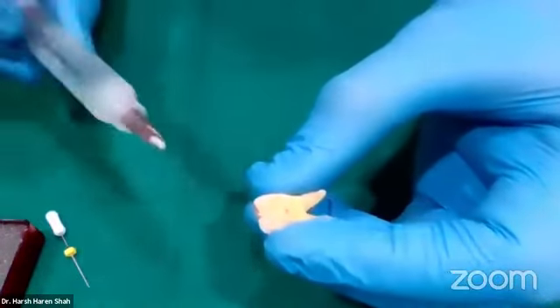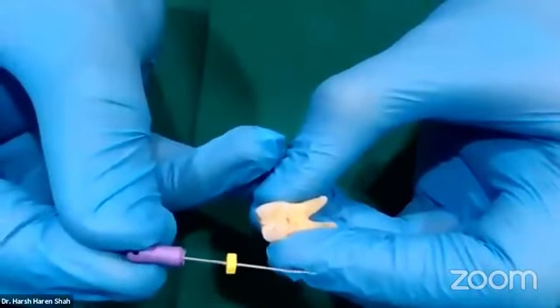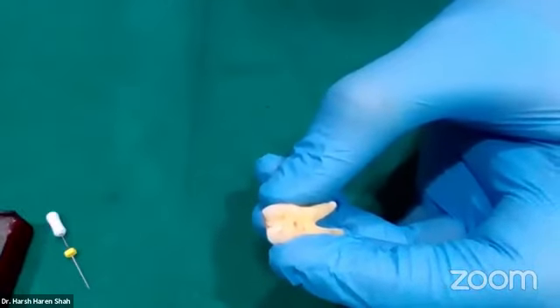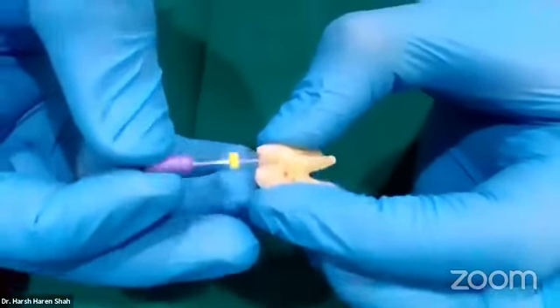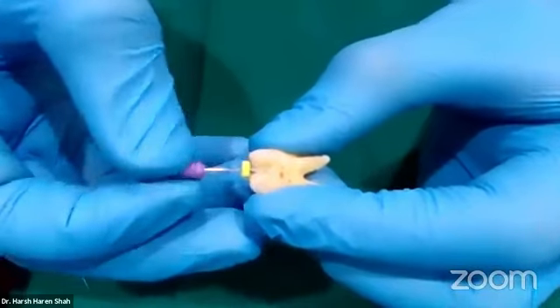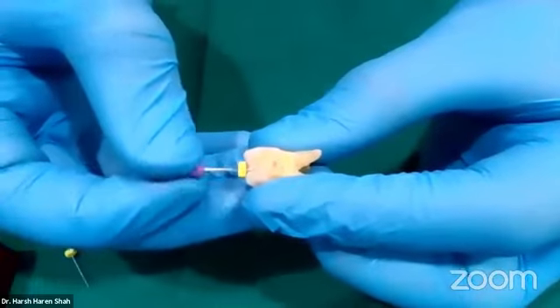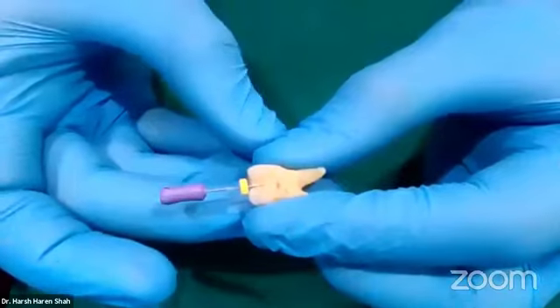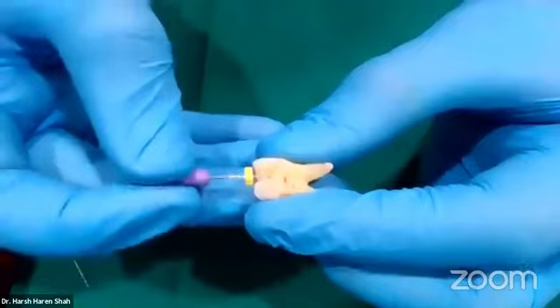Once your 15 is done, you will carry out the same procedure of irrigation, recapitulation with the same 10 number K file, and then irrigation one more time. If everything has gone well at this stage, my 10 number K file should be able to go till the complete working length without any hindrances. You can see the stopper, it is reaching the full working length. If I feel that I have to apply a lot of pressure, or I have to watch wind again to take it to the full length, this means that my glide path is still not complete. So that's how simple it is to prepare with a manual file.